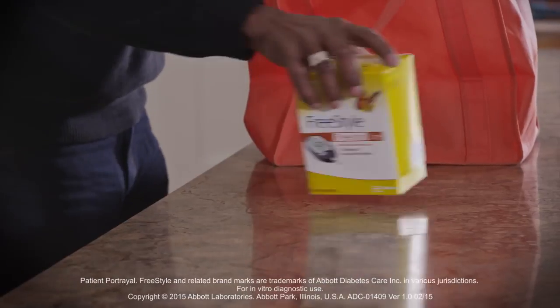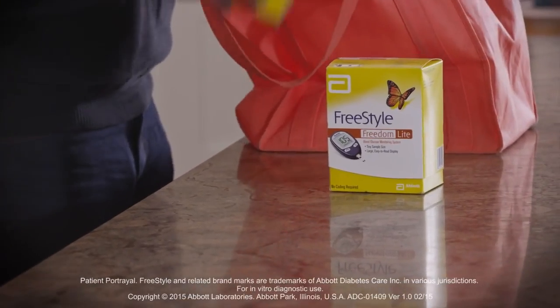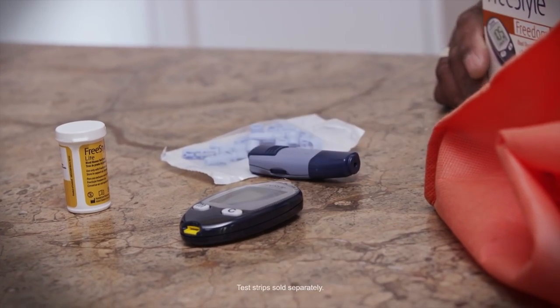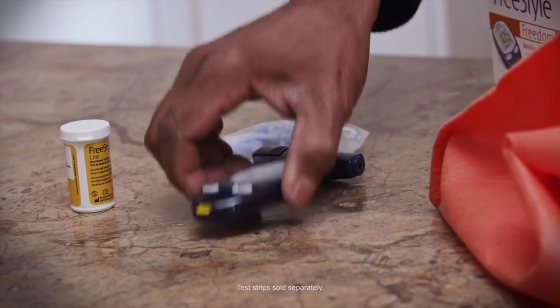Learning how to use your FreeStyle Freedom Lite blood glucose monitoring system is easy. Your kit contains everything you need to quickly begin using your meter. Let's get started.